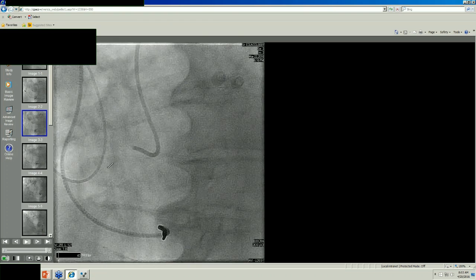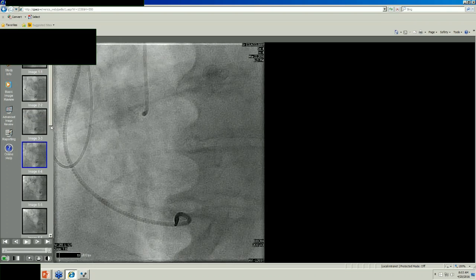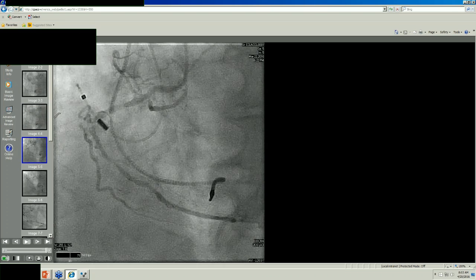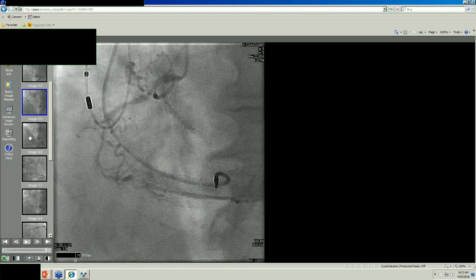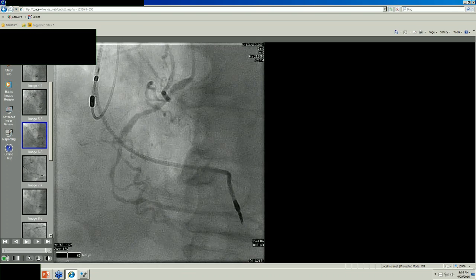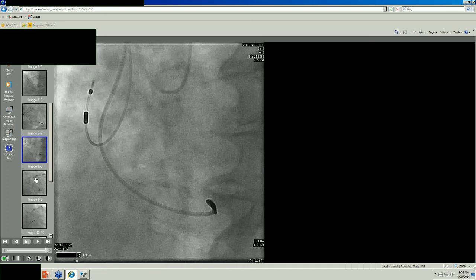And then trying to get the right coronary artery again, this time it looks like an Amplatz catheter. Let's see what happens this time, if we get the right or not. And whoopee, we got the right this time. The person gained from looking at the previous person's cath and realized you need a different catheter, and it looks like an Amplatz catheter was the catheter of choice to get the right. Couldn't get the right last time with the universal catheter.